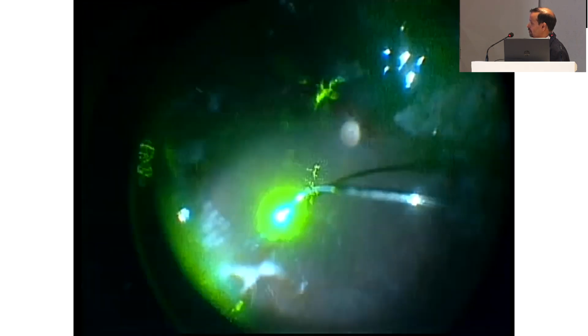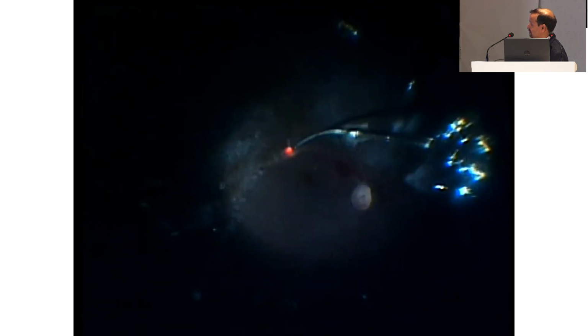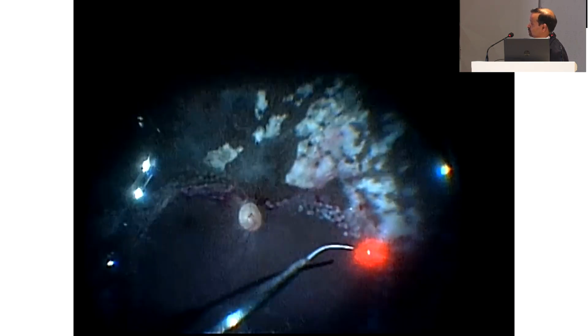Now in this particular patient there was a challenge because the retinitis in the infratemporal part was just approaching the arcade, but still I was able to, you can see here, it's reaching up till the arcade. So what I am doing is laser partly in the necrotic retina, but you need to extend your laser into the healthy retina so that it can hold on. So we laser it all around and put oil.